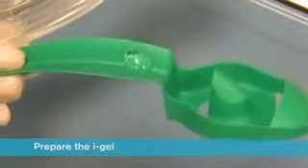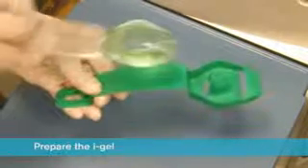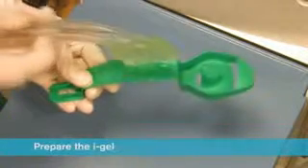Do not use silicon-based lubricants. Grasp the iGel with the opposite free hand along the integral bite block and lubricate the back, sides and front of the cuff with a thin layer of lubricant. This process may be repeated if lubrication is not adequate.